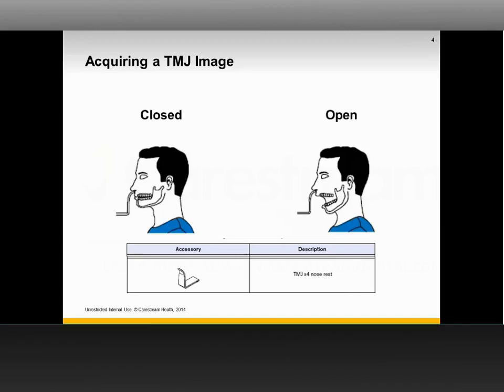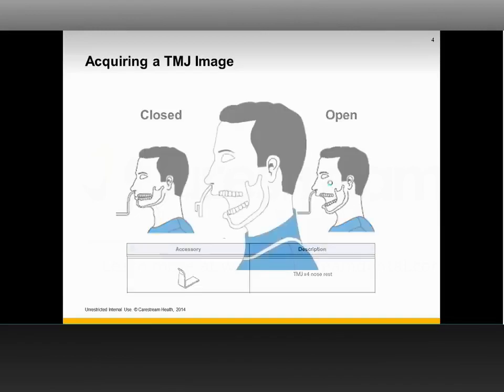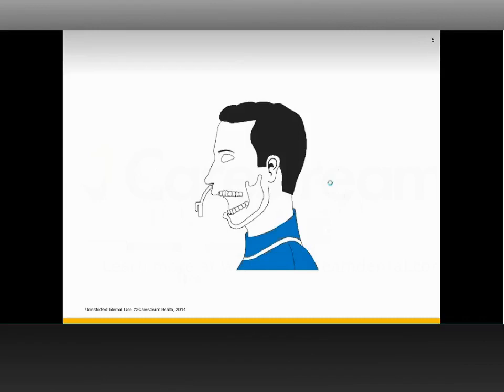So, to conclude, what would be the most ideal techniques to avoid any motion artifacts, especially when doing something like open and closed TMJ? That's a very good question. That is a technique-related question. One of the key things while doing any scan is to stabilize the patient's head with all the restraints that are available as a kit with the unit. It is important to stabilize the head first.